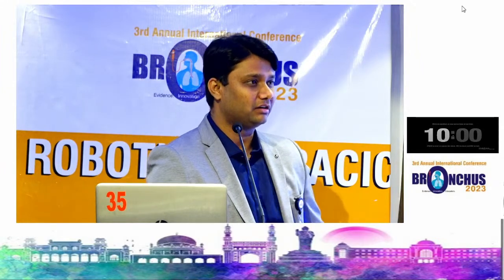And the inferior pulmonary ligament, releasing the middle lobe, that can always be done as the first step or the last. It's not going to change your steps anyway. The inferior pulmonary ligament can be released at any point.